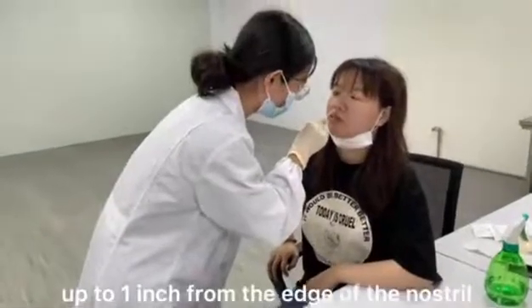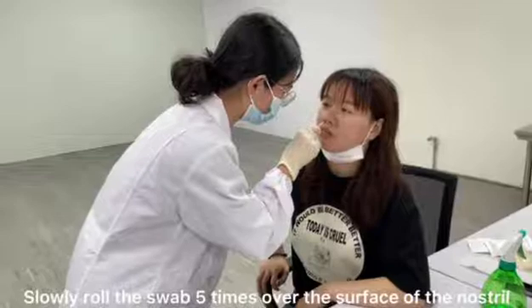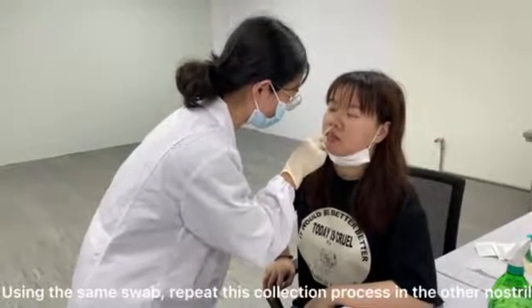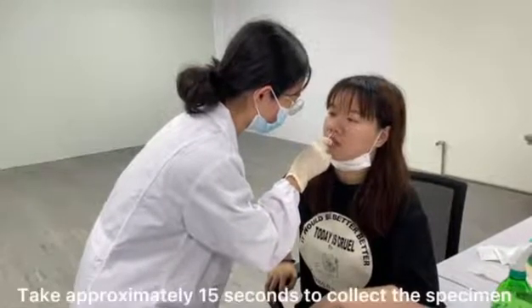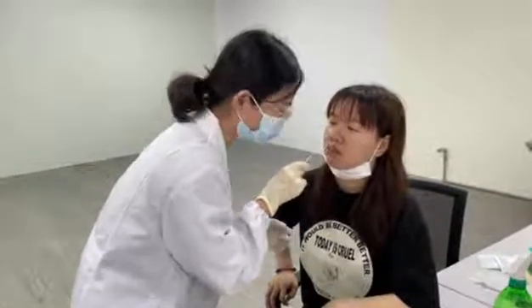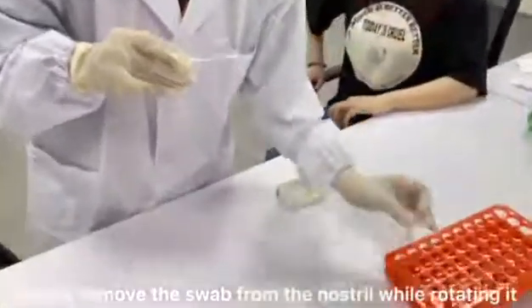Insert the swab into one of the patient's nostrils, up to 1 inch from the edge of the nostril. Slowly roll the swab 5 times over the surface of the nostril. Using the same swab, repeat this collection process in the other nostril. Take approximately 15 seconds to collect the specimen. Slowly remove the swab from the nostril while rotating it.